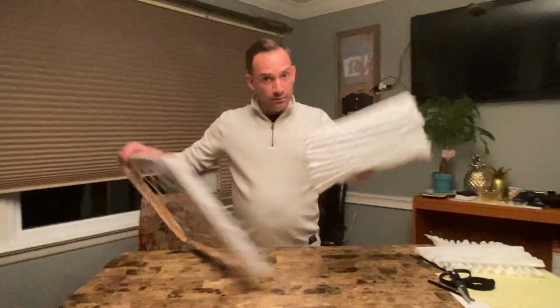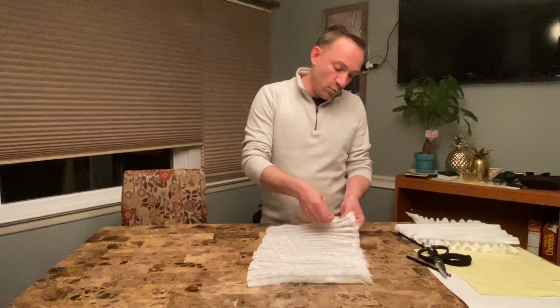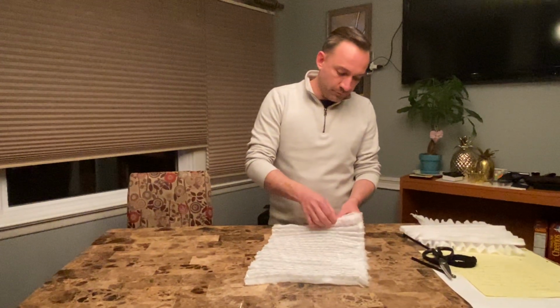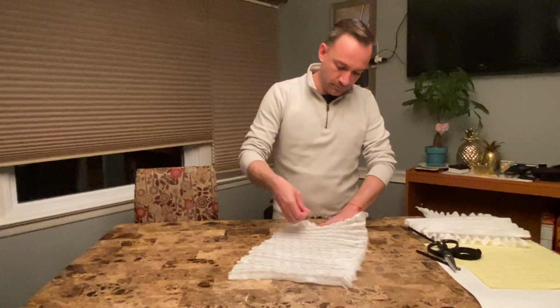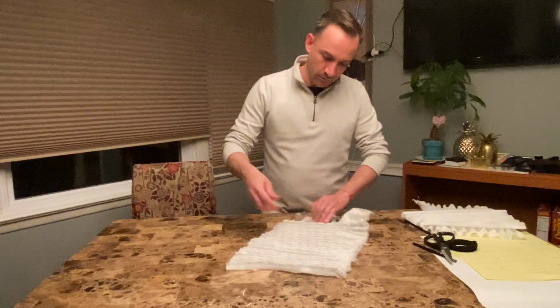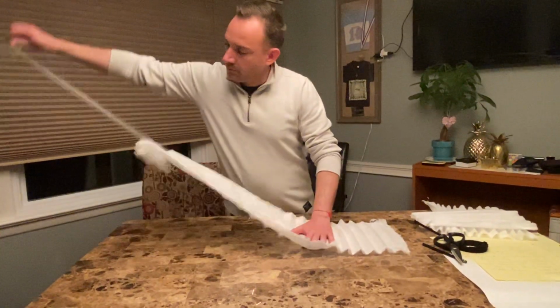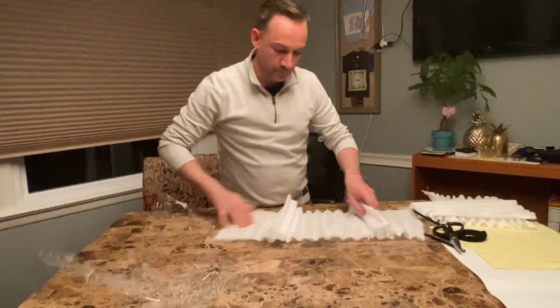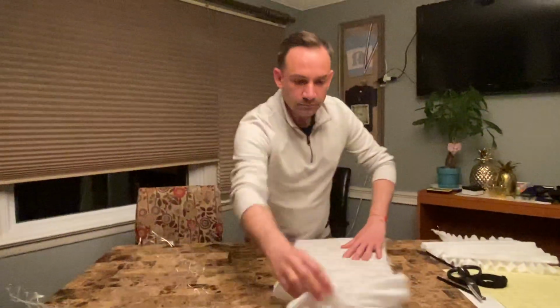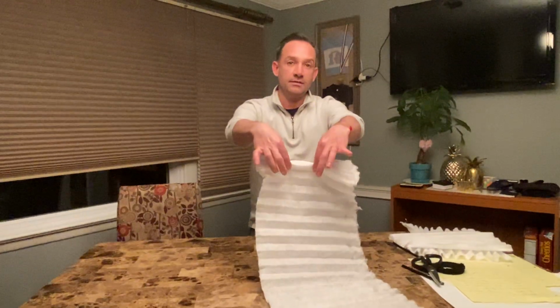After you take the whole frame out, you can throw it away. Recycle, please. And then carefully you start pulling the wire from one side. You hold it and slowly you take it out. See? And you take the whole thing out. Just be careful. Then you're gonna count 1, 2, 3, 4, 5.